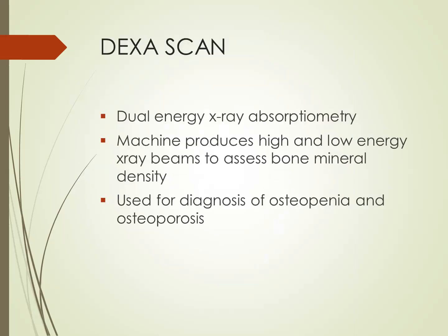The DEXA scan usually involves looking at the mineralization of bone, the bone mineral density. It is used to identify osteoporosis and osteopenia. This is particularly important again in spinal fractures and in back pain, to identify the weakness in the bone, because of which the back pain usually occurs. And hence, the DEXA scan has its importance in lower back pain.